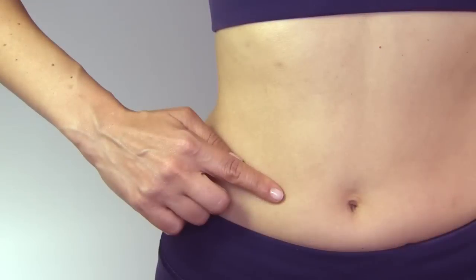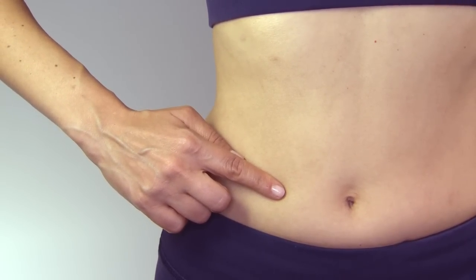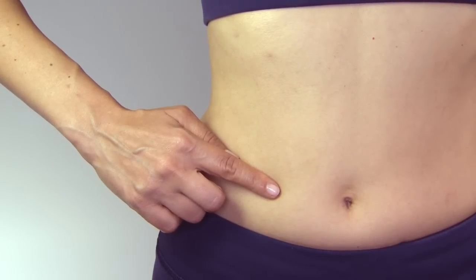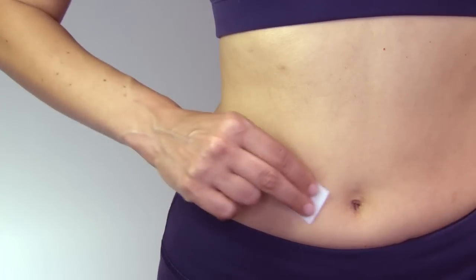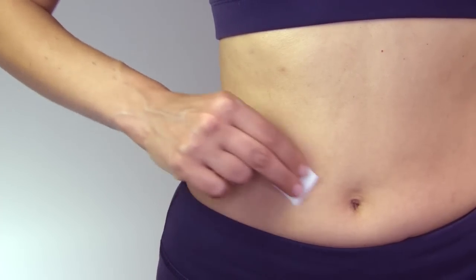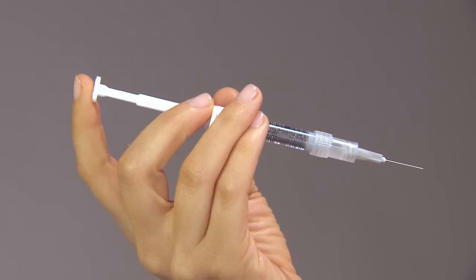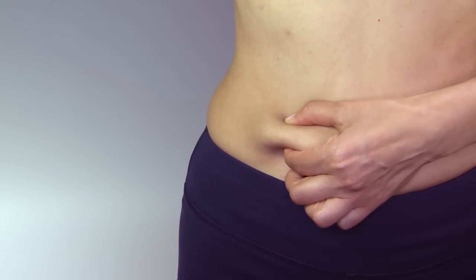Step 3: Inject. Choose an injection site in the lower abdominal area, preferably around the belly button but at least one inch away. Choose a different injection site each day to minimize local irritation. Take an alcohol wipe and clean the skin at the injection site and allow it to air dry. Hold the syringe with one hand the way you would hold a pencil. Pinch the skin on the chosen injection site with the other hand.